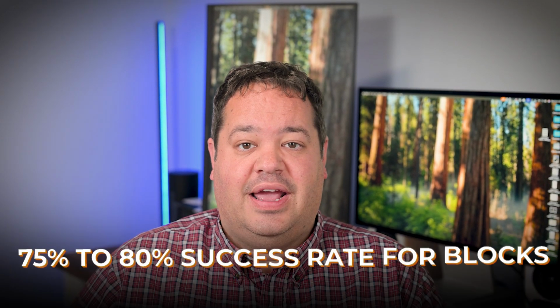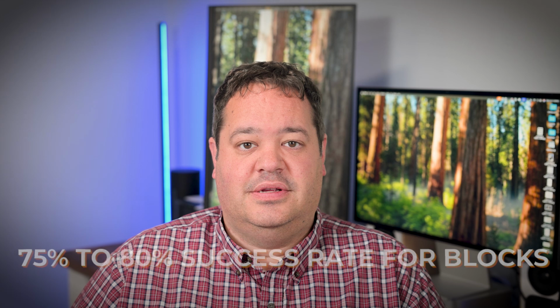You should be able to have at least a 75 to 80% success rate for blocks with that first stage. If you are lower than that, then you probably need to review your technique. I might make a new video on that shortly to help. But if the block is not perfect, I will do 1 articaine in the block and then infiltrate half buccal and half lingual to try to take care of any accessory innervation. That works almost every time.